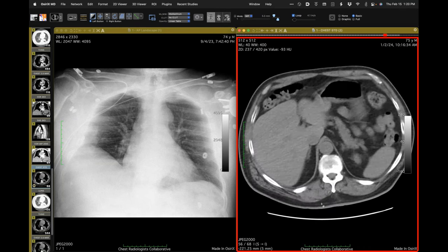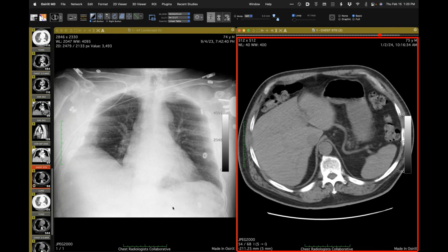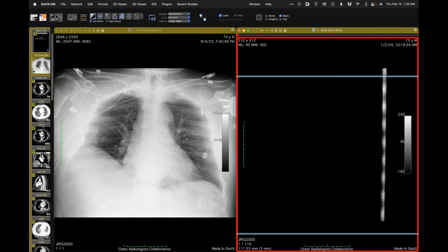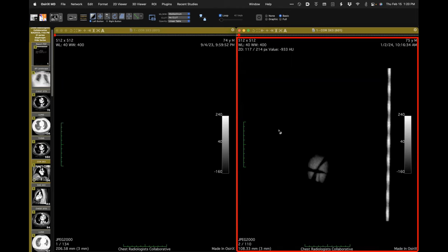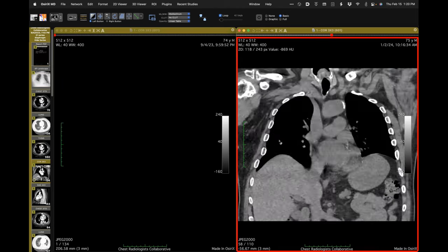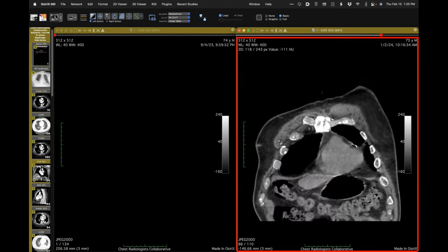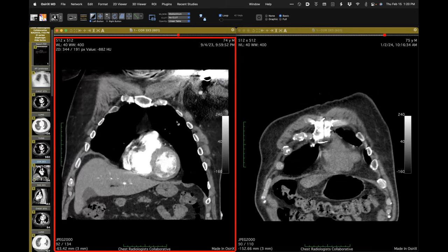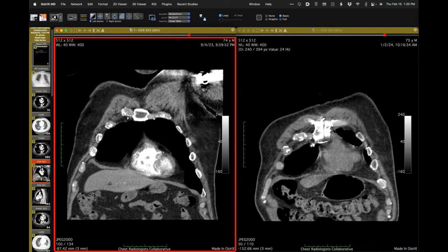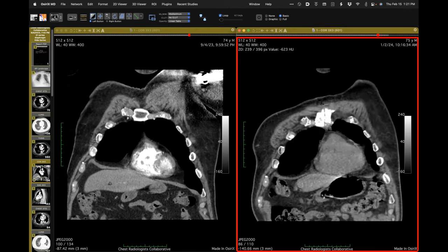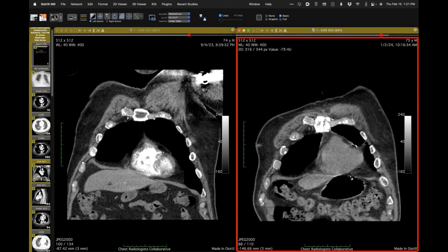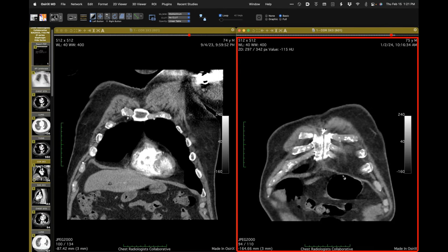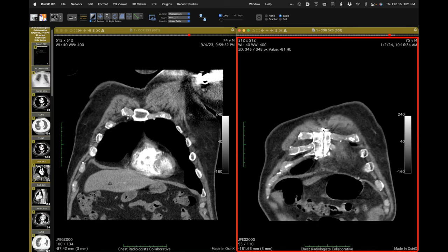Could you show us a coronal view at the time of the thinning — going anteriorly to see if we can see anterior muscle asymmetry? Going anterior in the prior study versus the recent one — it's thinned out. That anterior muscle thinning on the coronal is really helpful. That's a definite change.